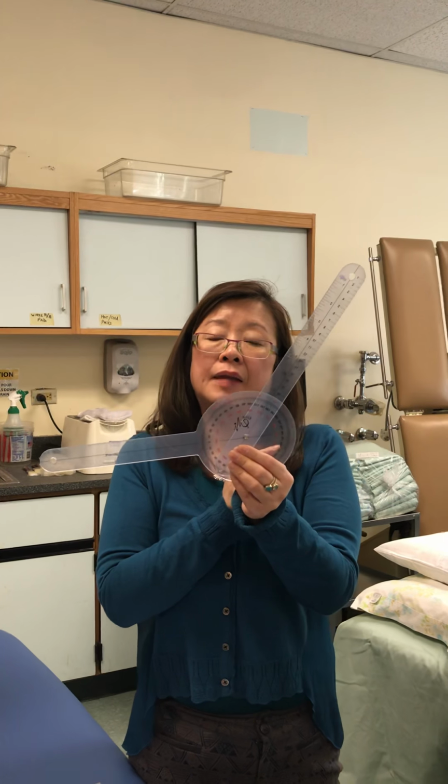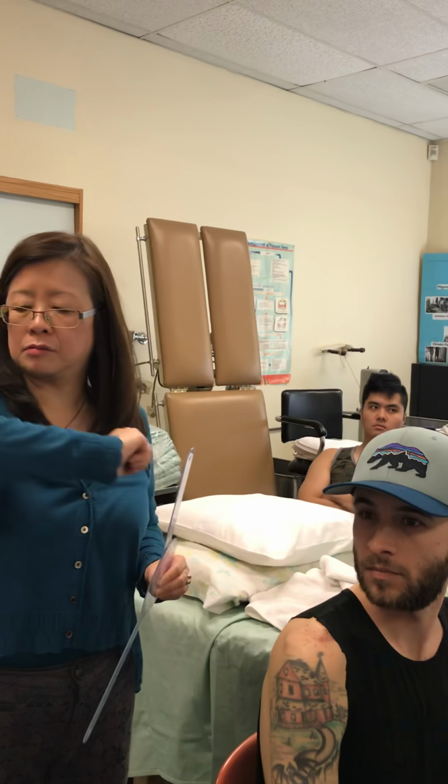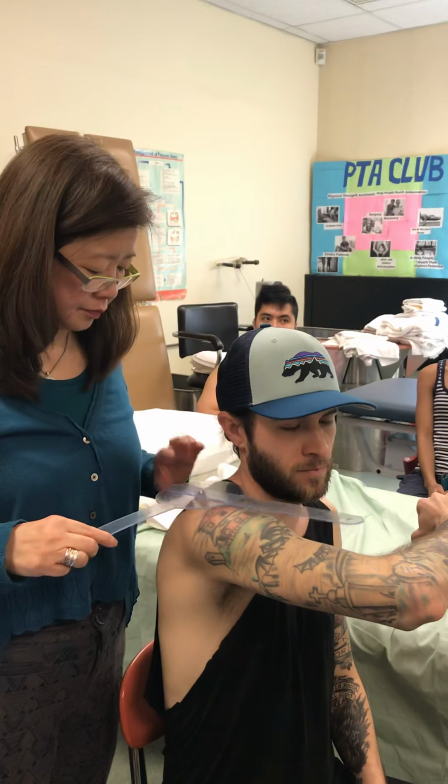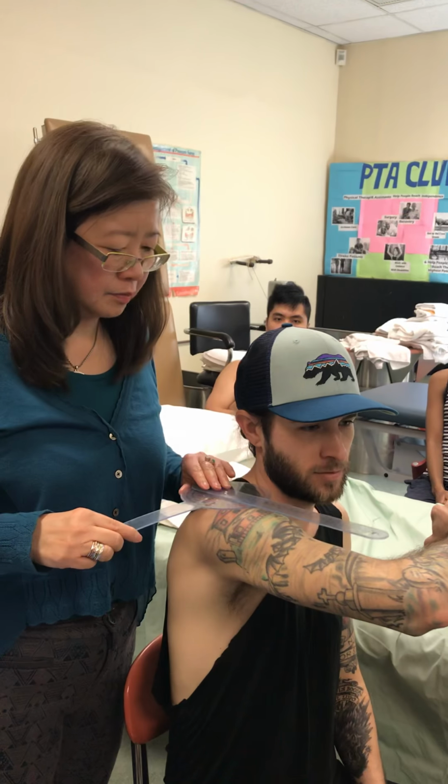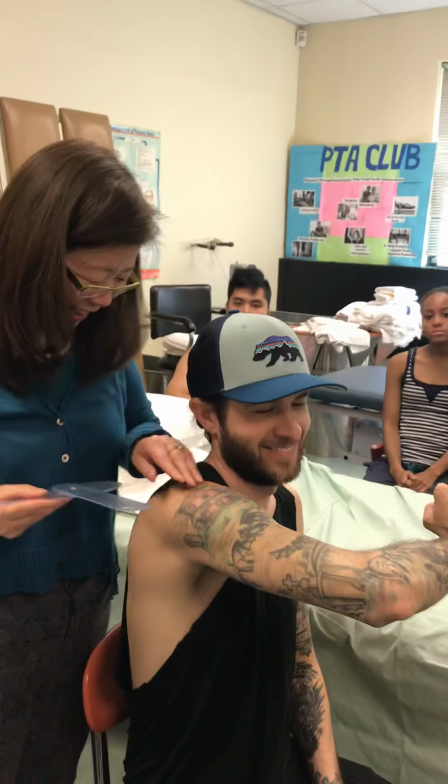Okay? Now for horizontal abduction, what would I ask him to do? If he's like this, tell me one easy instruction for him. Pull your elbow back. Yeah, bring your elbow back. Oh, wait for me. Let me line up first. I didn't line up.